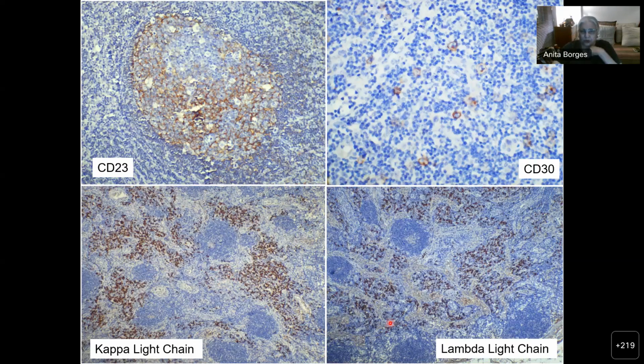It's absolutely normal. If you wanted to say that the kappa to lambda ratio is really high, it has to go 8:1 or 10:1 or even more than that for you to say that there is a kappa light chain excess, or even to say that there is kappa light chain restriction.